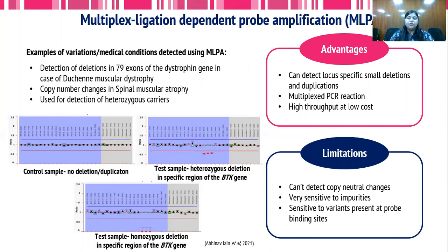MLPA is also very sensitive to impurities — if there is a little bit of control DNA contamination in the test sample or vice versa, that would lead to aberrant results. Additionally, it is very sensitive to variants present at the probe binding site, which could affect the outcome.